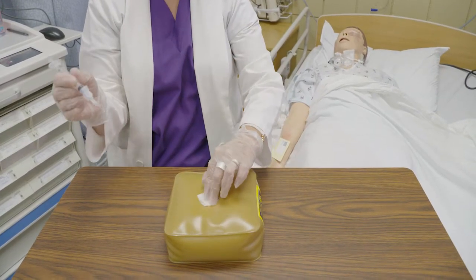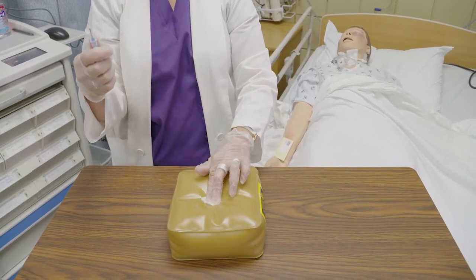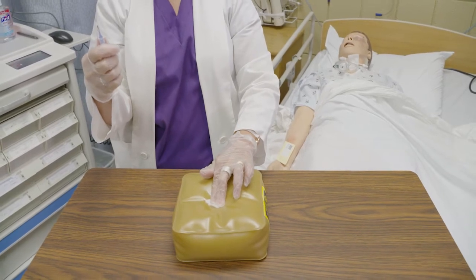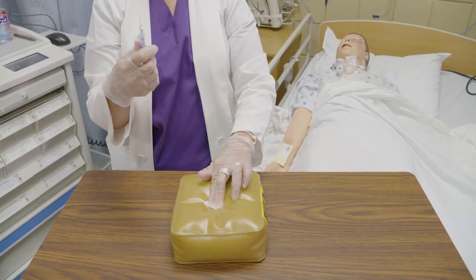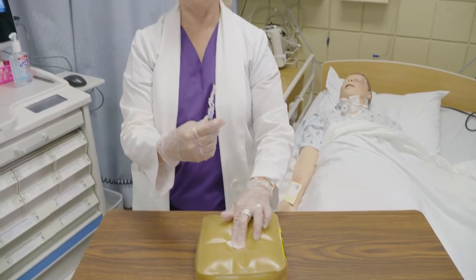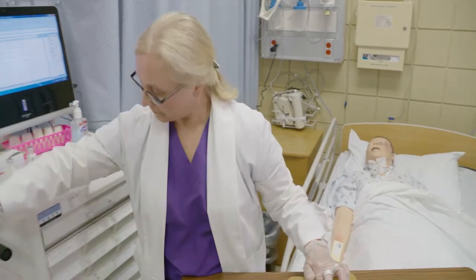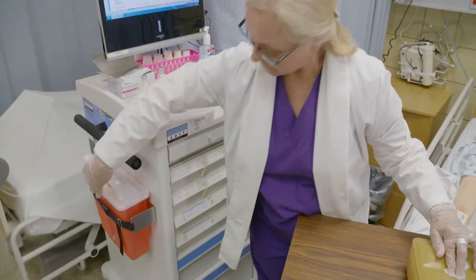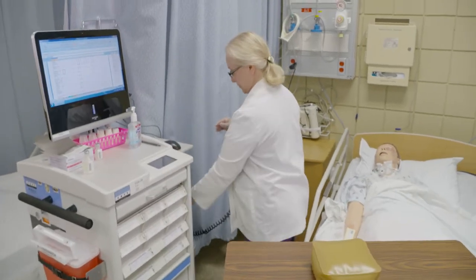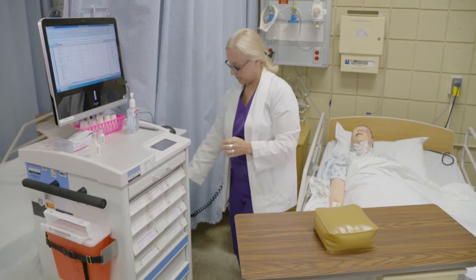Withdraw the needle and apply gentle pressure on the site. Do not massage the area. It will alter the rate of absorption of the medication. Activate the safety guide using your thumb to cover the needle. This prevents you from being stuck by the needle. Discard the needle into the sharp container, putting the needle end first into the opening. Remove gloves and perform hand hygiene.